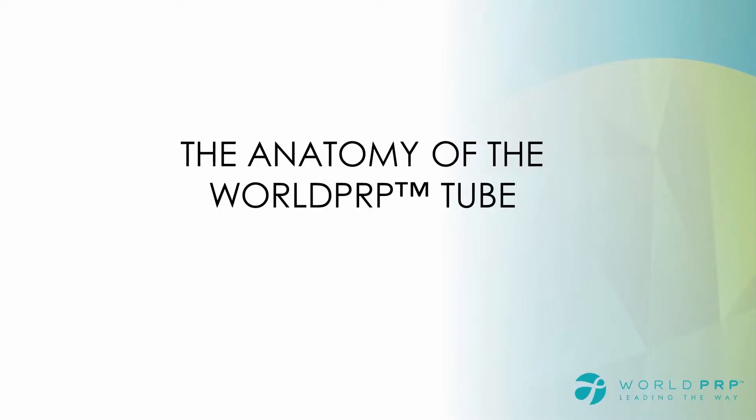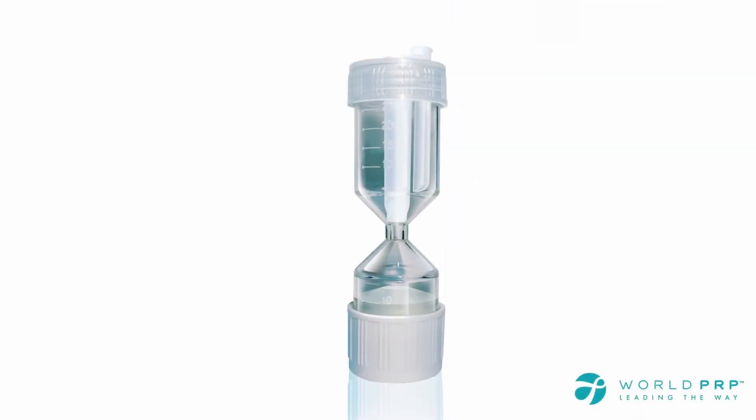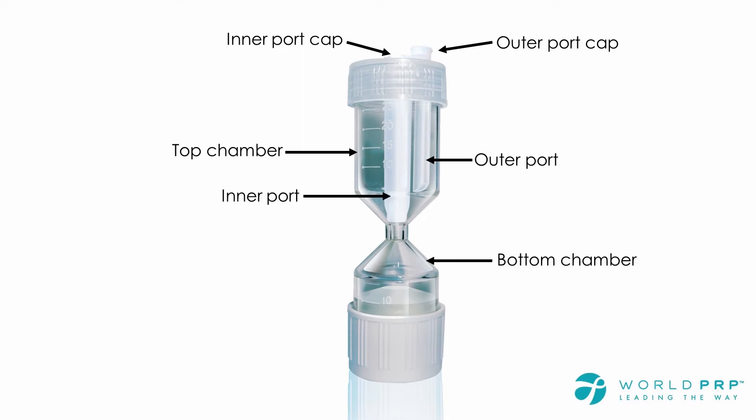World PRP tube anatomy overview. The World PRP components are outlined in the image. The outer port cap is used to carefully insert the collected blood sample through the outer port into the top chamber of the hourglass. It is also where after centrifugation you collect the quantity of desired platelet rich plasma. The inner port cap and the inner port is an opening where a 1 ml syringe can be inserted at the surface of the buffy coat for its removal by aspiration from the neck of the device. The inner port also acts as a separator between the top chamber and the bottom chamber.